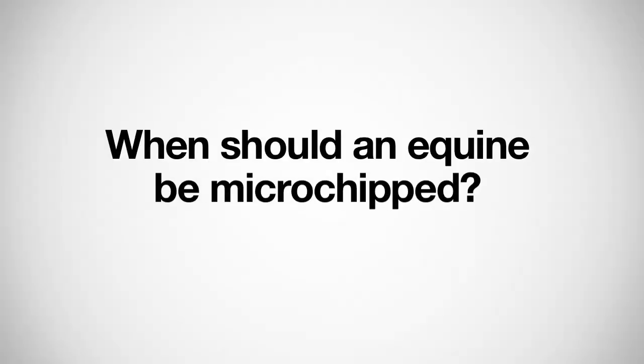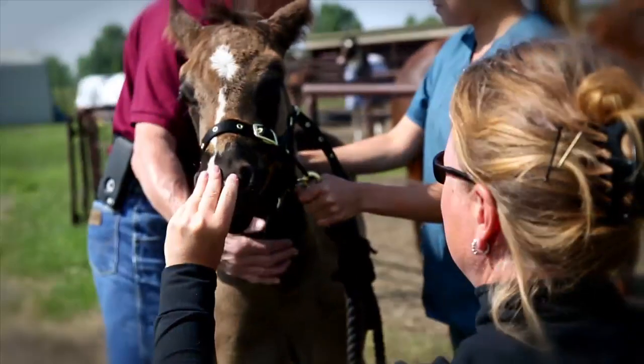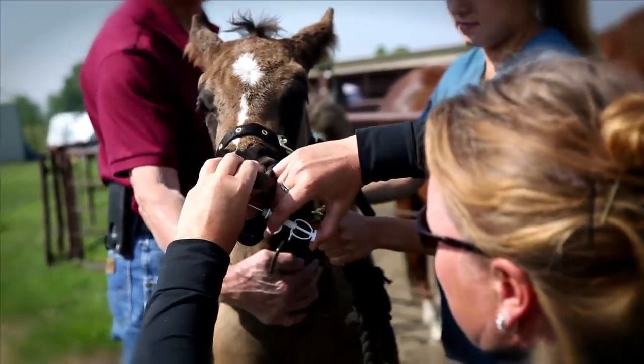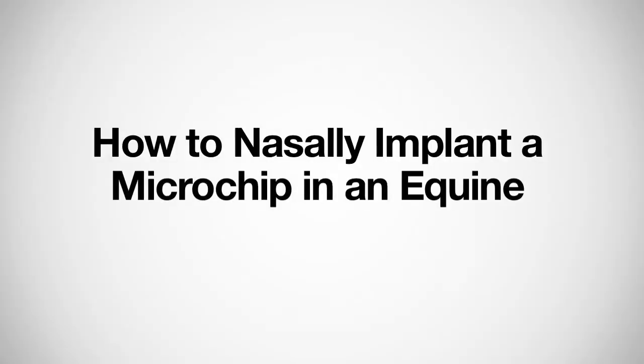When should an equine be microchipped? This microchipping location is suitable for all ages of horses, including newborn foals. How to nasally implant a microchip in an equine.